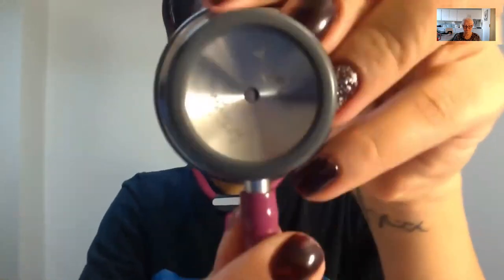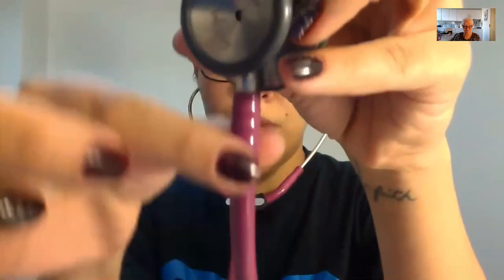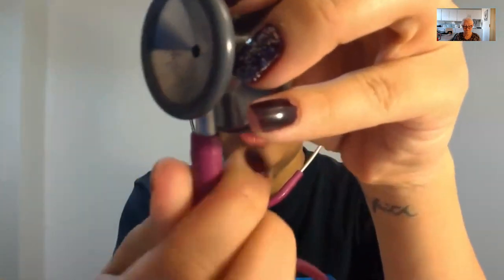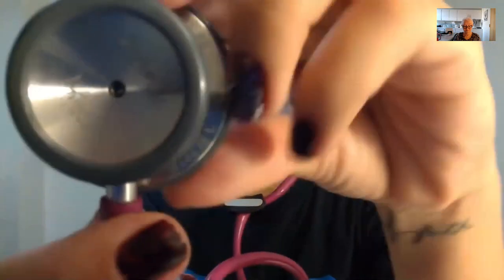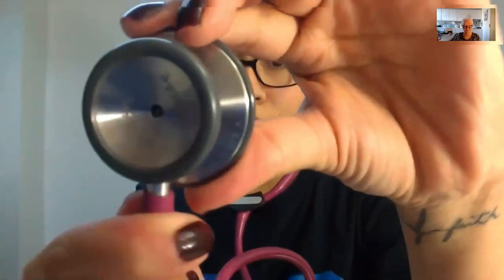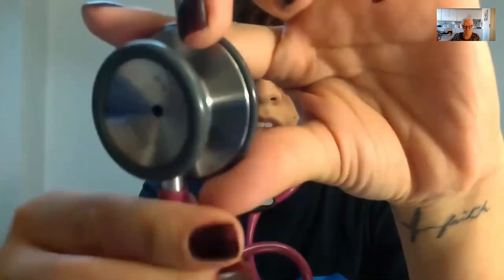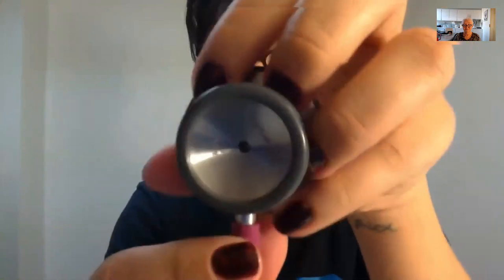And the way to open and close your bell is on your stethoscope. If you turn or twist it, on mine, it's either way, I can turn it right or left. I don't know about other stethoscopes because, like I said in my previous video, we only own this one and I've had it for 3 years, so I don't know about other ones.